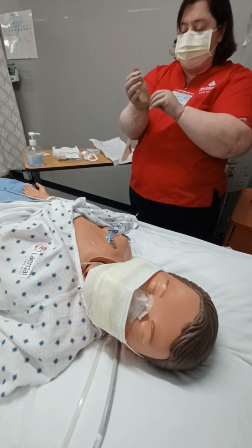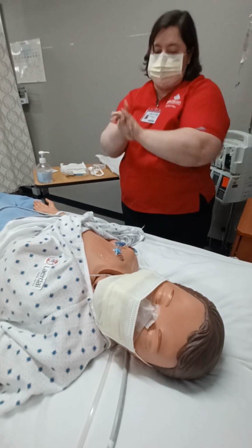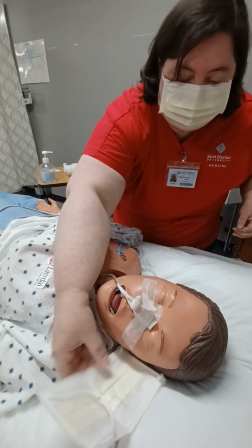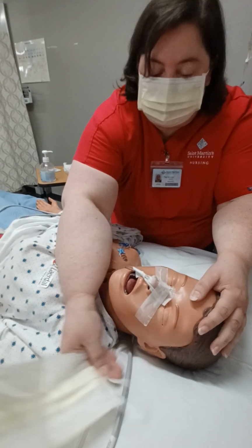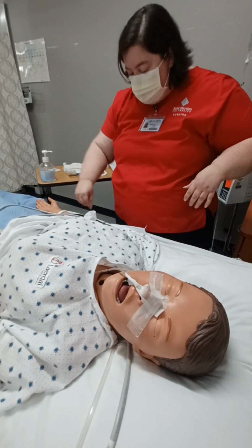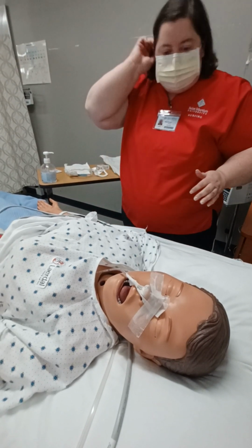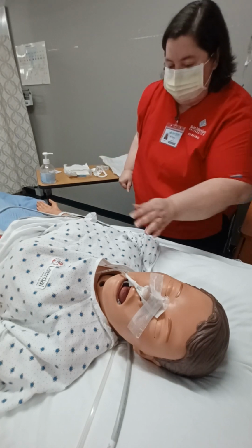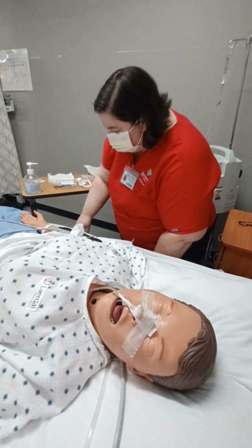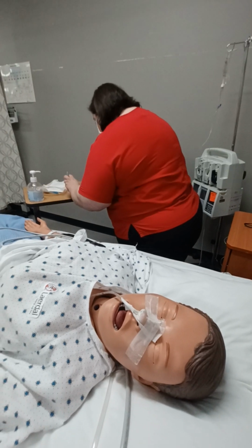All right, so then I would remove my gloves, perform hand hygiene. Gonna go ahead and remove your mask because we're done with the sterile portion. Sorry, that got back behind there. Gonna put your drape back over you. Do you have any questions or concerns as far as pain or anything? Great. So make sure that you have your call light. I would clean up all of my garbage. I have to put this on here.